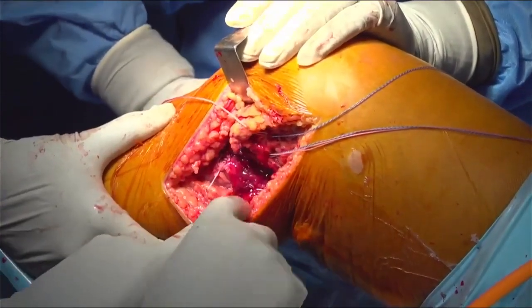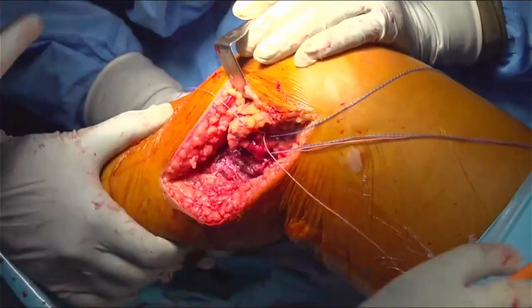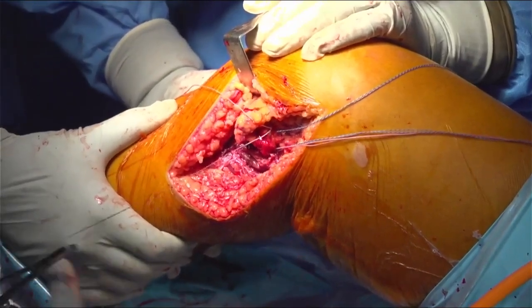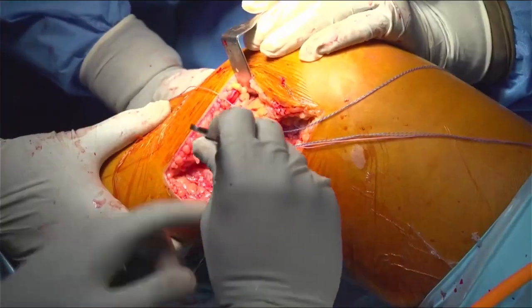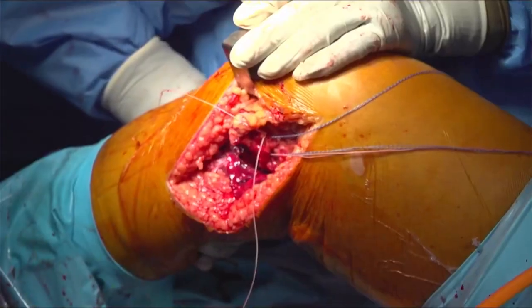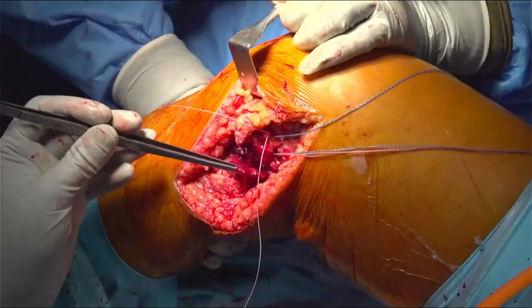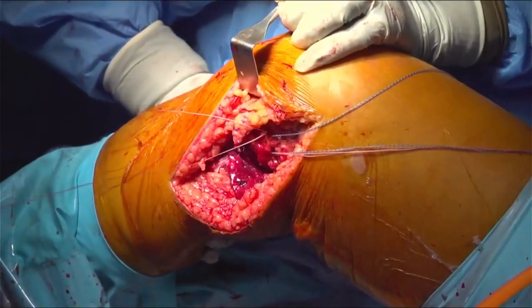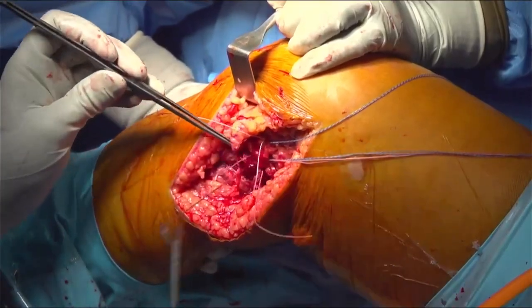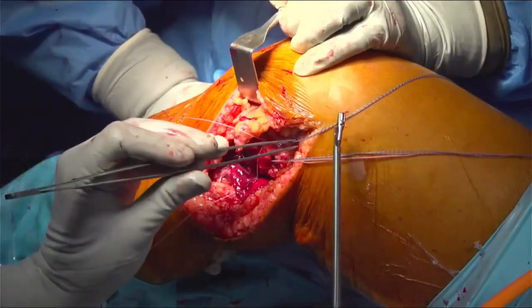Non-tooth forceps please. Now this is the posterior layer. I would like to include this layer also into my repair. Tooth forceps please. So if you see, this is my important layer which I need to repair. This is the posterior capsular layer which also needs to be repaired. So I'll pass my wire into this also, and that will help my repair. Blue one please.